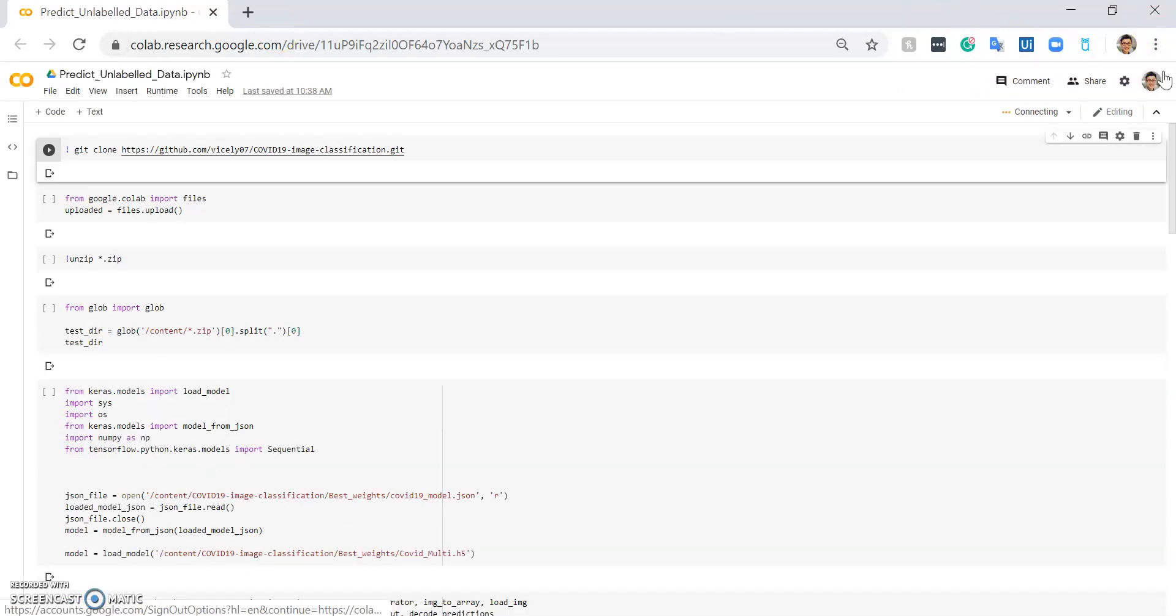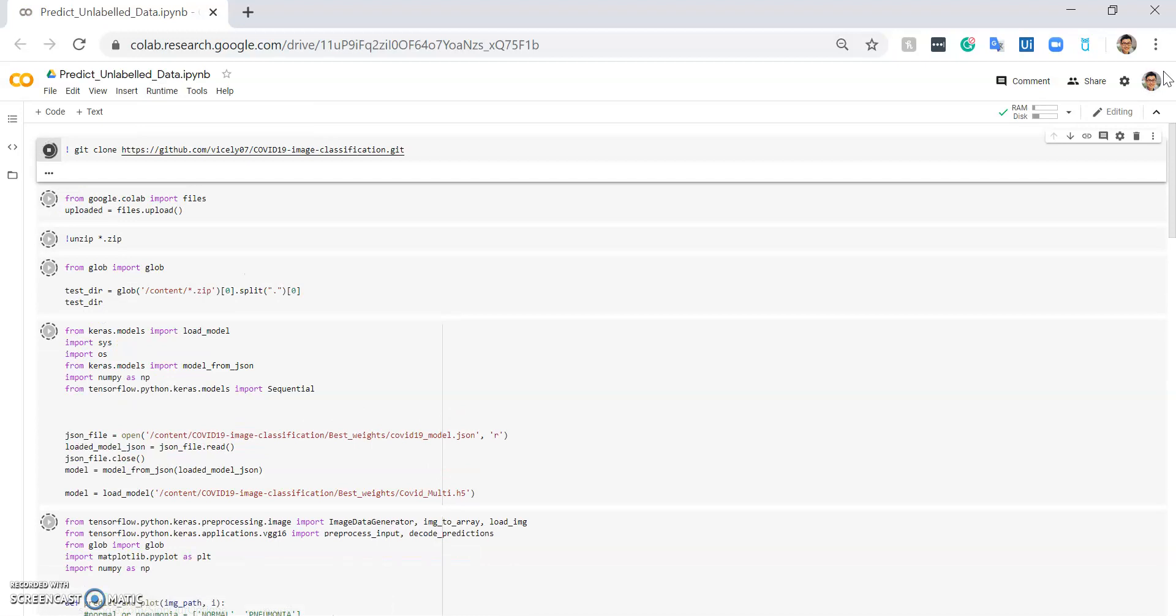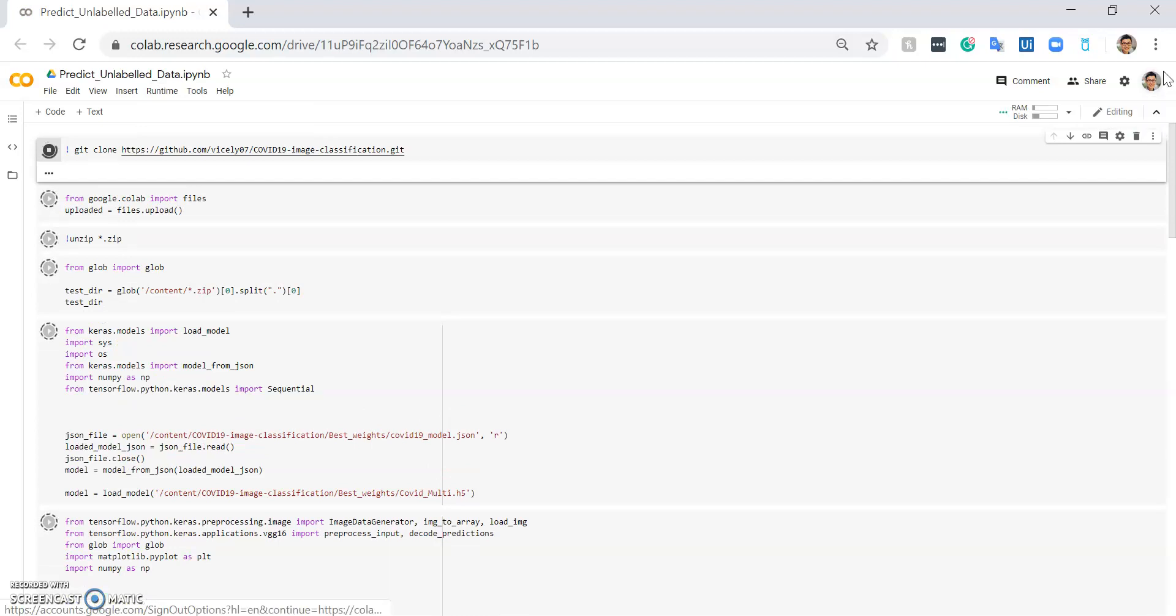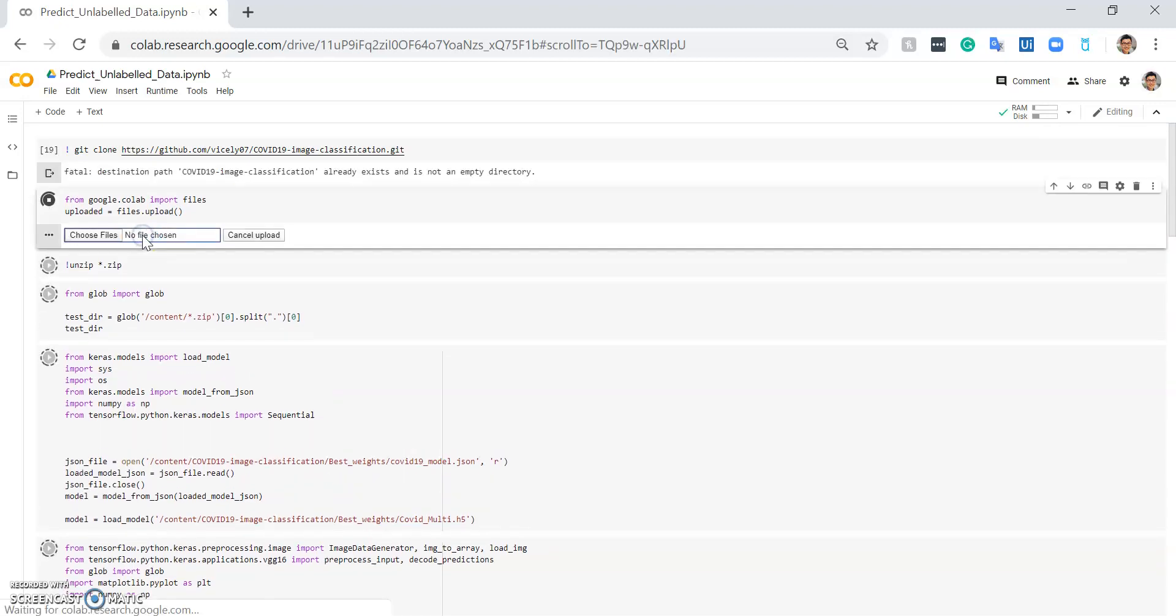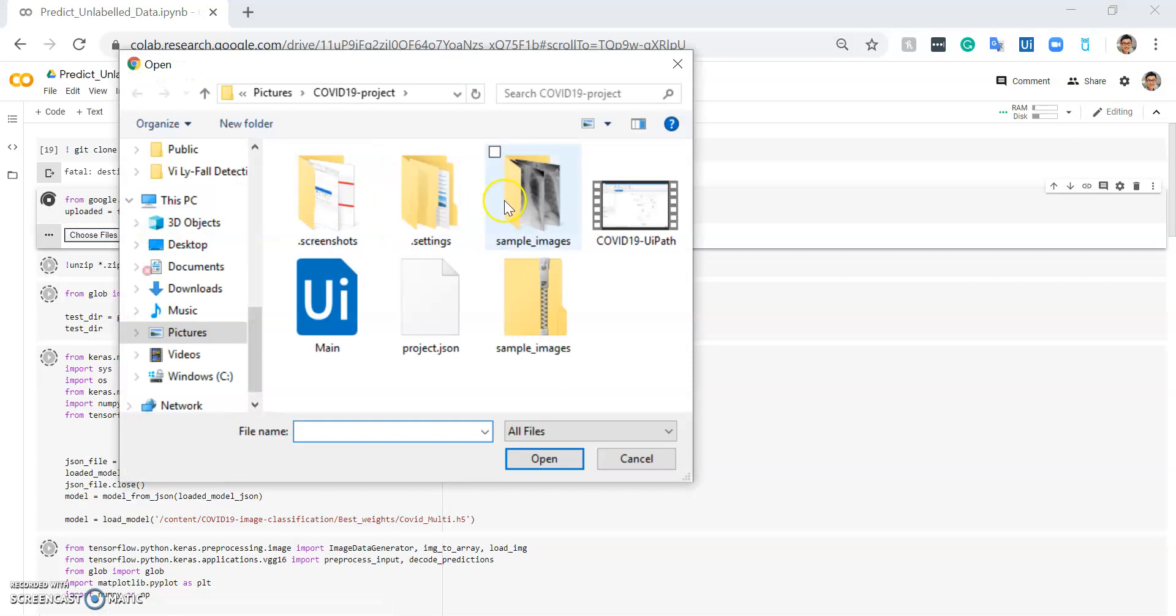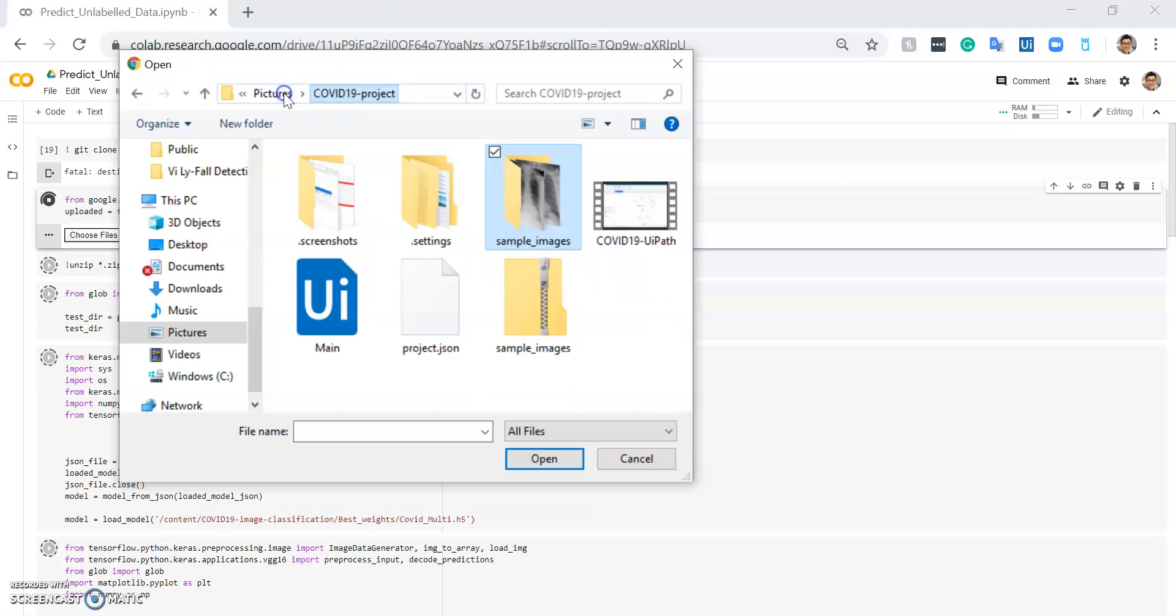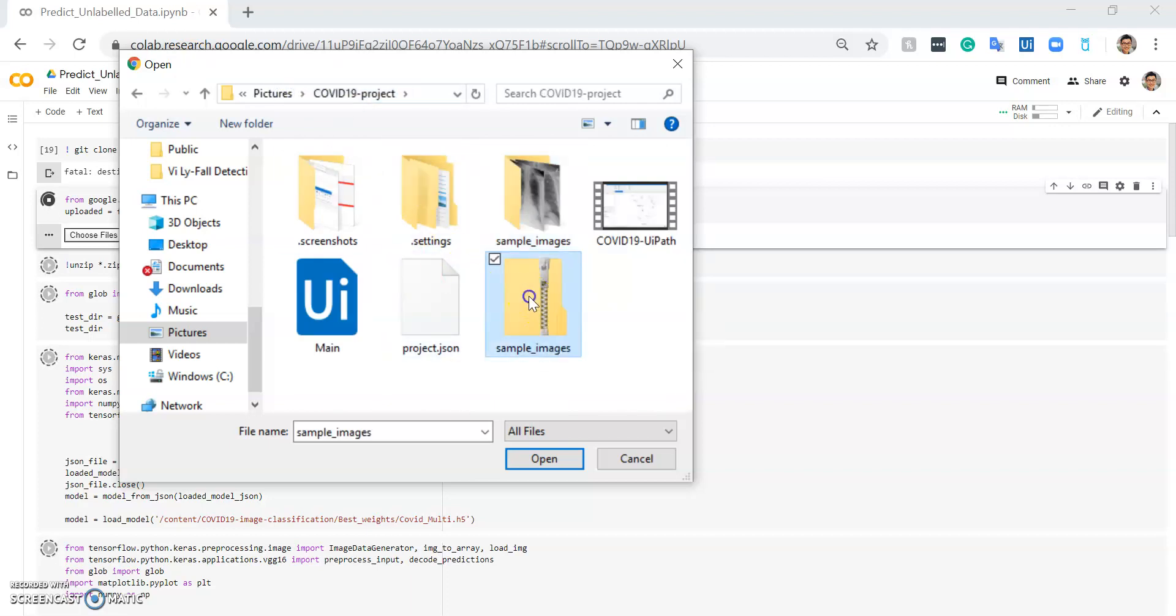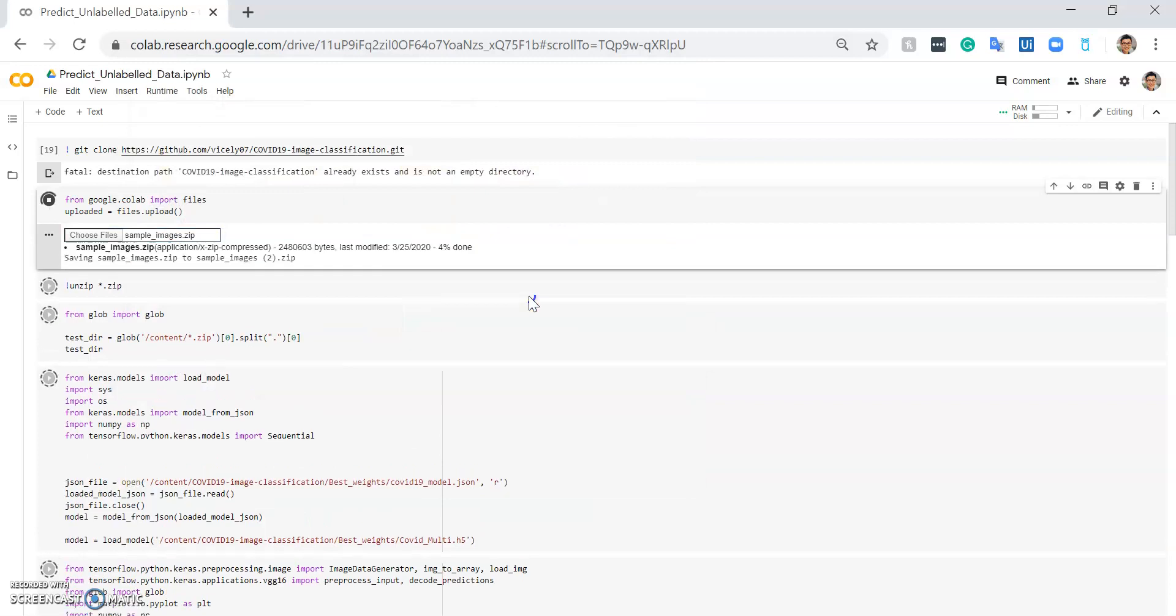After I run the Google Colab deep learning model, it's going to ask me to input a chest x-ray image folder. The folder looks like this - I prepared it beforehand. It includes all the chest x-ray images that I want to test, and I put them into a zip file so the deep learning neural network can use it to test for signs of COVID-19 or pneumonia.